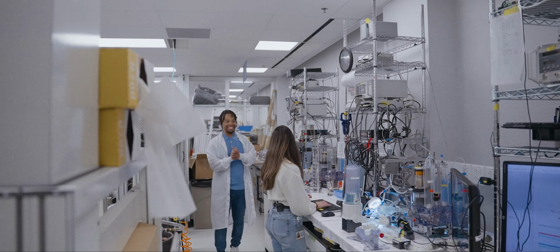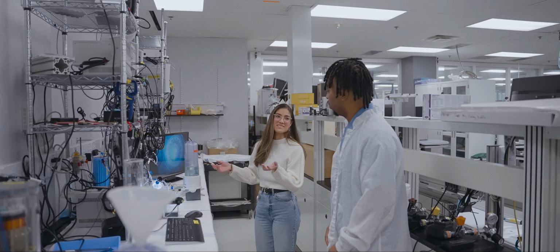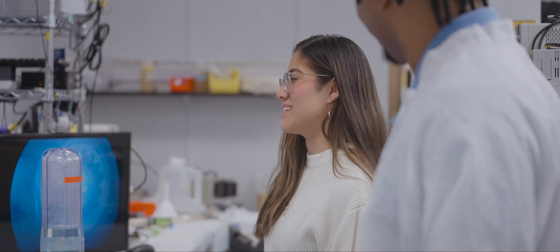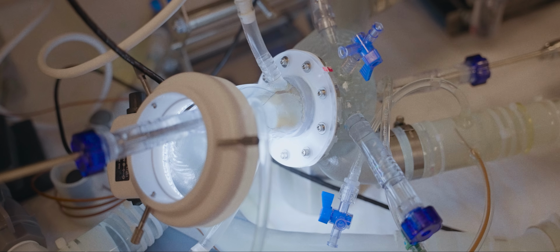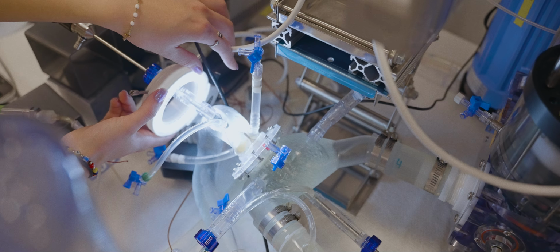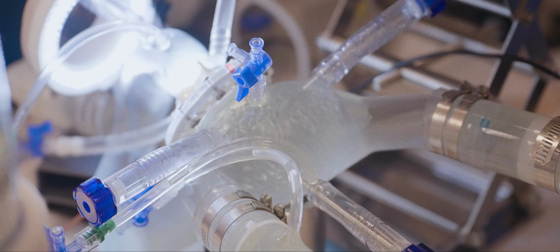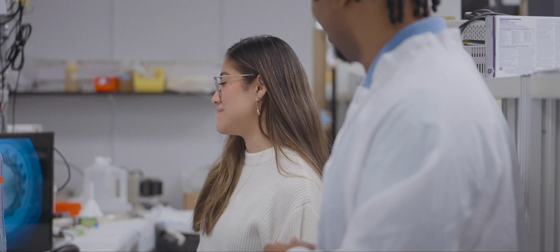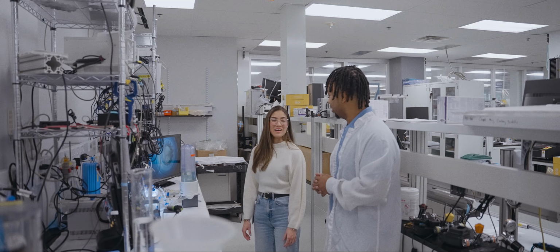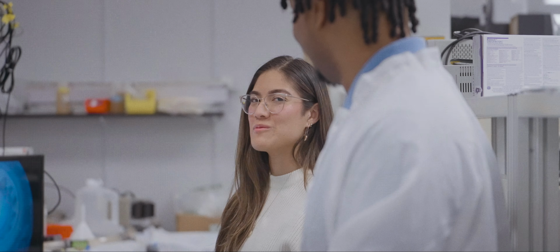Yo, what's up, Liz? Hey, Juice. So what exactly do we have here? Yeah, I'm excited to show you. Boston Scientific makes medical devices, and then we need to figure out a way to make sure that those devices work. So my team builds systems that act kind of like the human body so we can test our products. That's dope. If we look in here, this is actually meant to model a human heart, and we have a heating element to mimic what body temperature would look like. Testing is never perfect, so then we have some major updates that happen because of that. So that's a big bulk of my work here.